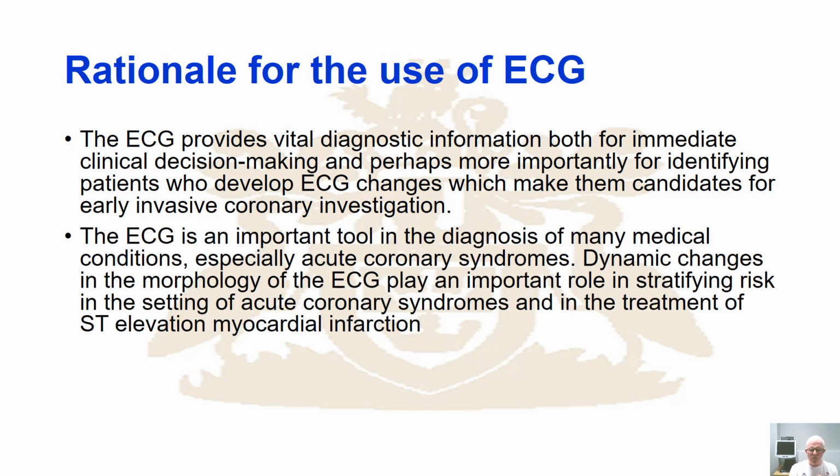Coupled with that, it is very, very useful in diagnosing medical conditions. So we know, for example, acute coronary syndrome, but also the fact that you can now monitor this electrical activity of the heart. As you'll see, the change in the electrical activity is linked to the activation and deactivation of key structures and therefore key responses, which means that you can start to understand the dynamic changes in the morphology of the heart. And so you can start to really understand if there have been adaptations or limitations to the heart.